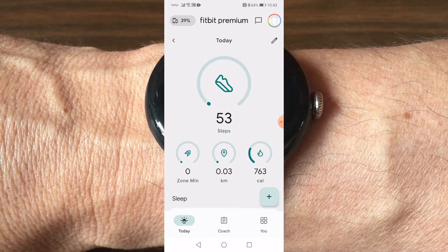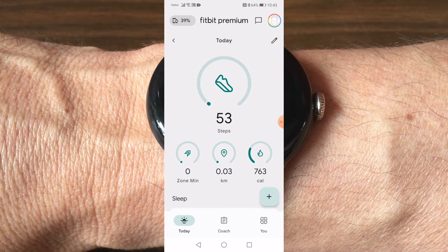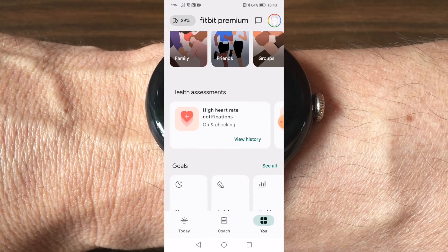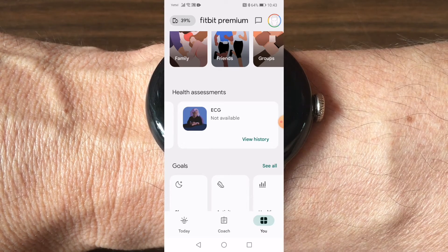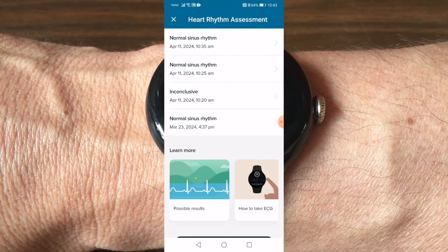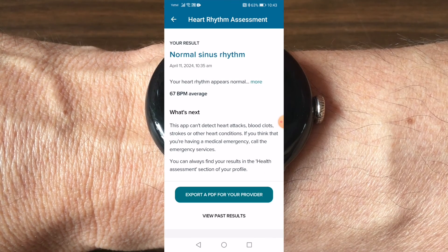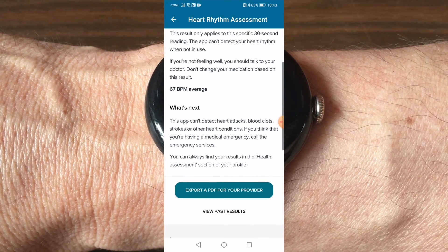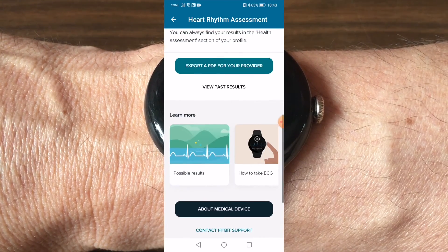In order to access these results in the Fitbit app, click on the 'You' tab in the bottom right-hand corner. Then under 'Health Assessment', find the ECG section and select 'View History'. The last five ECG readings you've taken will appear, and you can click on each to look at more details. There's also an option to export a PDF of the reading, which can be shared with your doctor or a loved one.